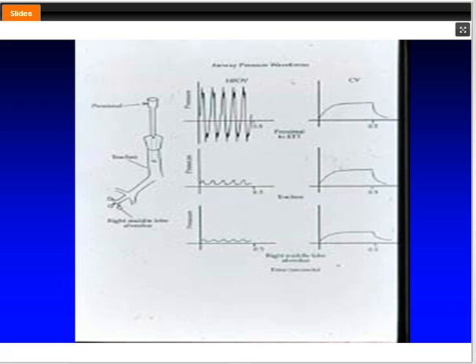Well, how is the pressure transmitted? Again, this is a study that we did when I was in San Antonio, in which we put a capsule on the surface of a rabbit lung. As you can see, the high-frequency pulsation, the part on the left, has a very wide pressure swing at the top of the endotracheal tube.